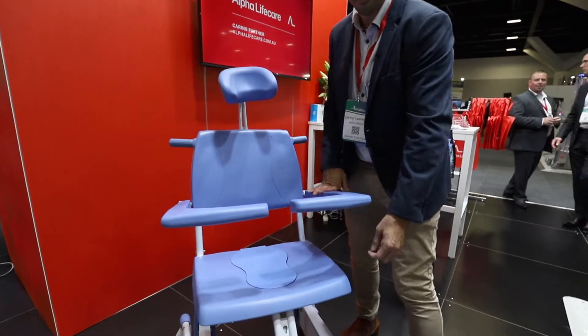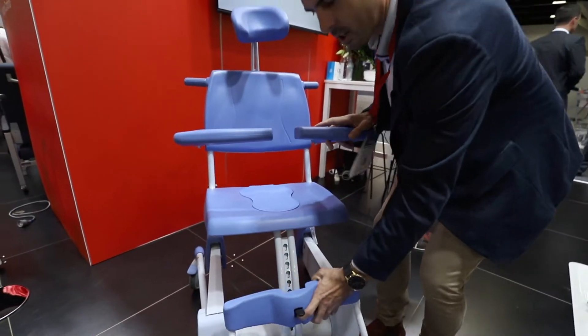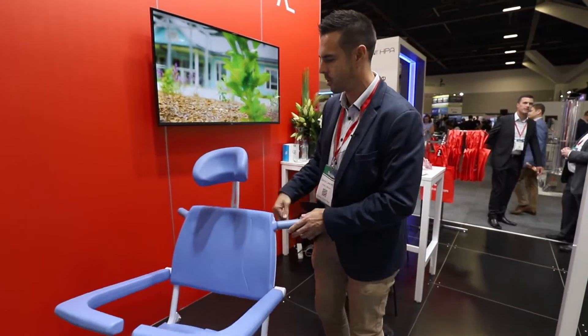This particular model has a center mount footrest that can be completely removed to avoid tripping and adjust for longer legs or shorter legs. It has four casters, all with brakes, really easy to maneuver around.